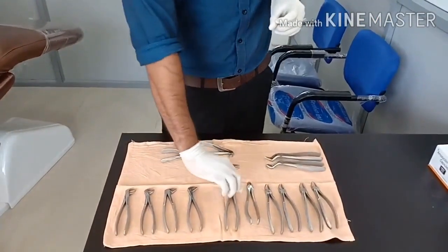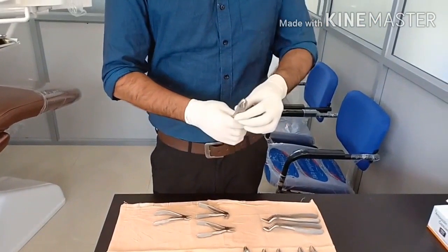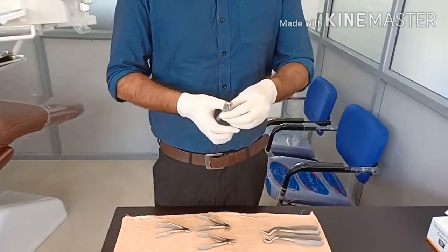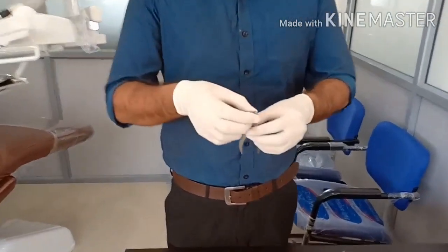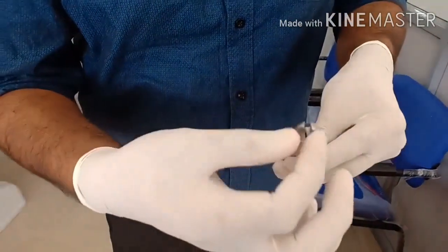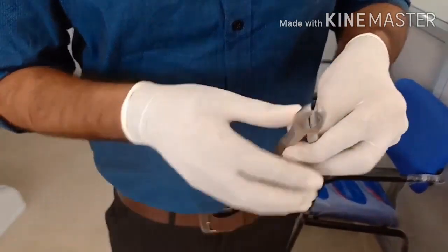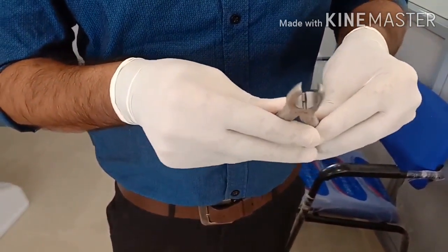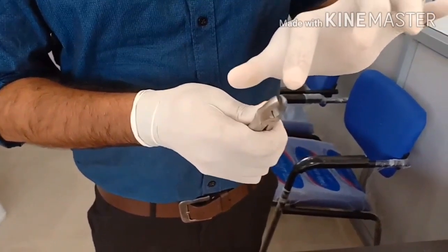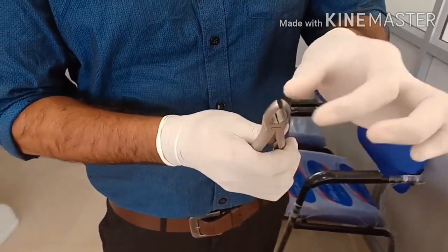This is the forceps commonly used for upper anterior tooth extraction. You can see the beaks are not very close to each other — a slight gap is there. It is used for upper central incisor, lateral incisor, and even for canines. You can hold it firmly and perform the extraction of upper anterior teeth.